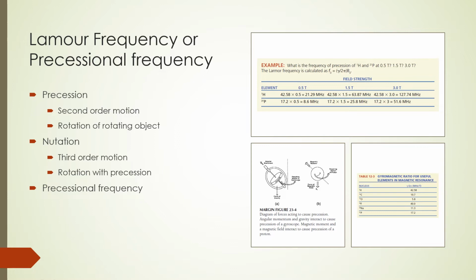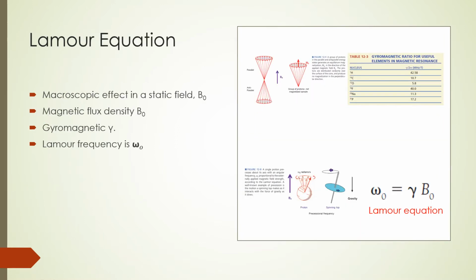The precessional frequency of the hydrogen atom is shown in the table above. A hydrogen atom or proton having spin is classically like a bar magnet, even though its magnetic moment is undetectable. On a macroscopic scale, protons are randomly aligned, so there is no bulk magnetization. When the material is placed in a strong static magnetic field B0, it becomes magnetized with a net magnetization vector as protons line up along the field. This is shown in the top left figure.